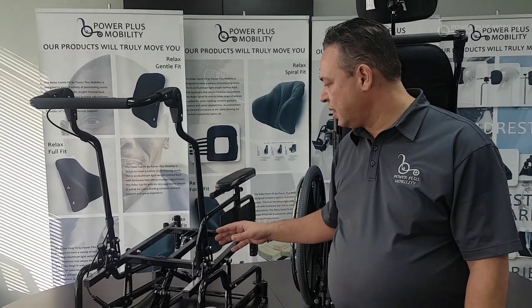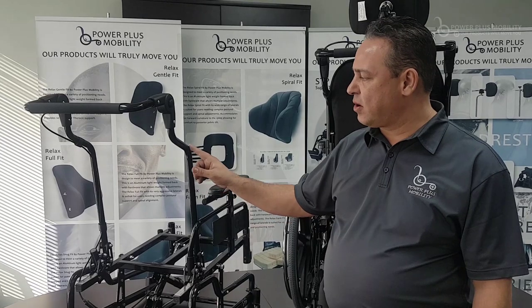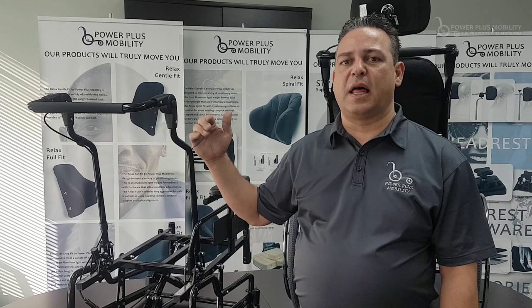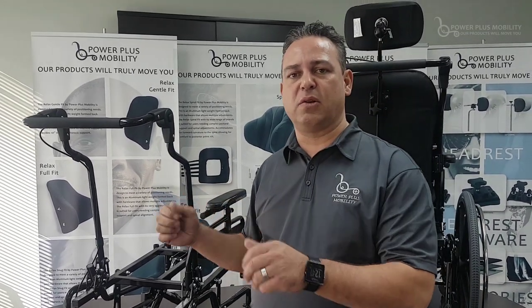we can easily cut down the tubing and bring down the price of the back canes. One of the standard features on our back canes is that we have a contoured bend through here, which pulls the back cane away from the chair and allows for the caregiver to reach the back cane and to stroll with the client in it.